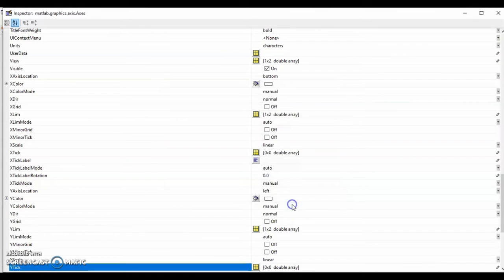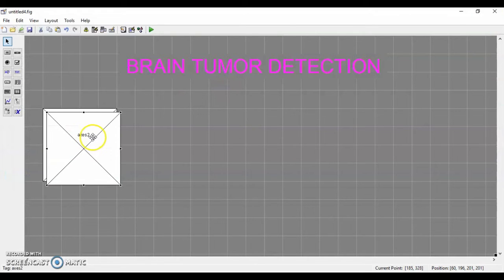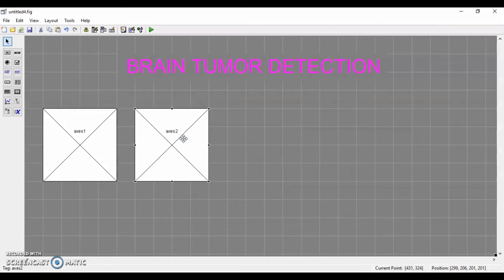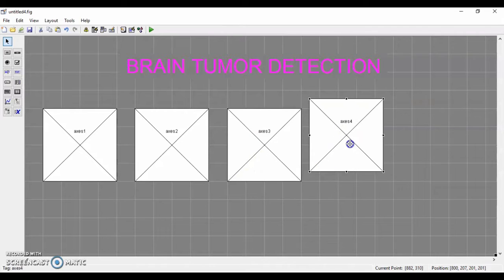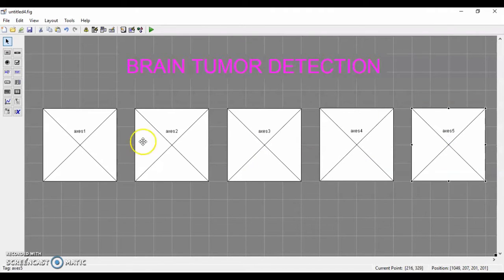So next, we will copy and paste the graph box according to the number of boxes we needed. In this case, we will copy 5 of it. Then we will select push button to create different functions.